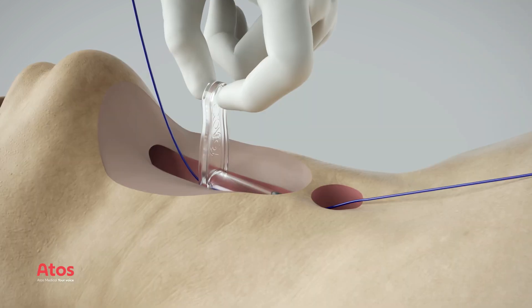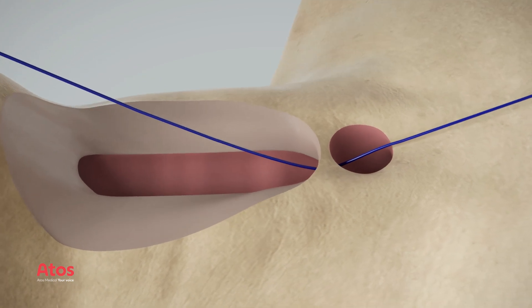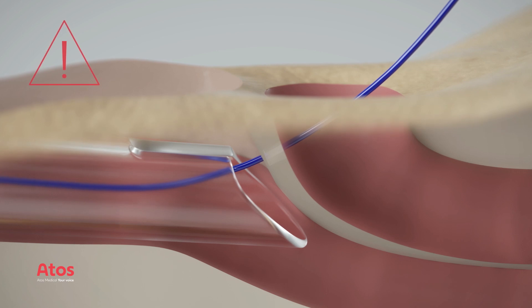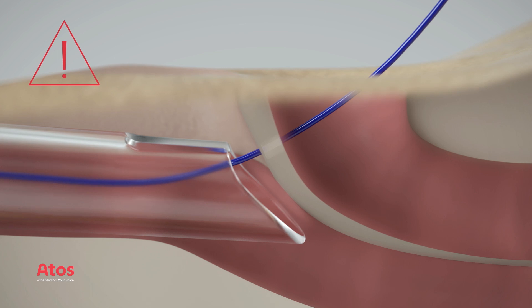Remove the puncture needle, then remove the pharynx protector. Only the guide wire should remain in situ before continuing. Due to the risk of damaging the esophageal tissue, do not remove the pharynx protector prior to needle removal.